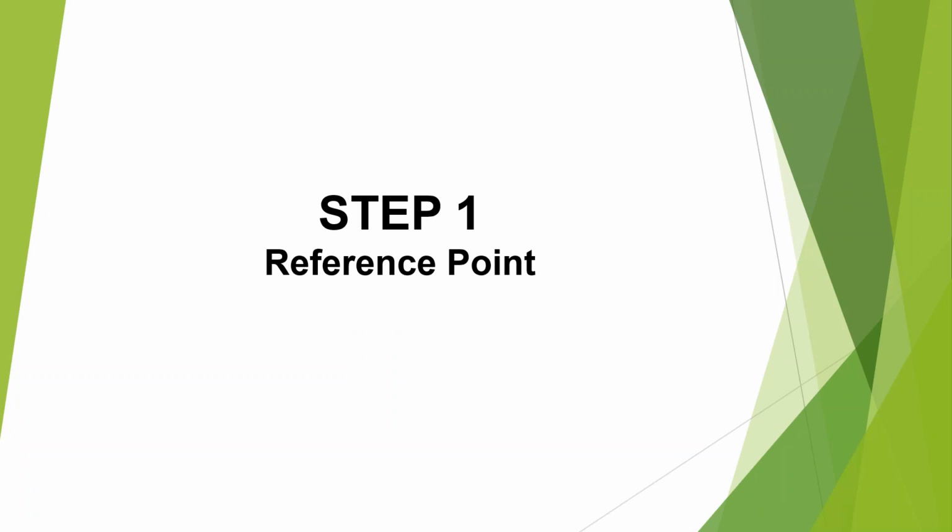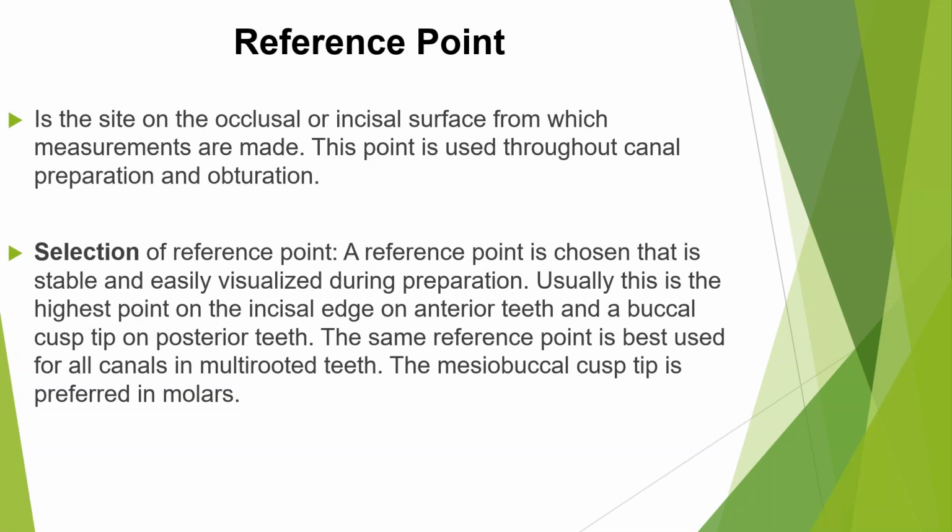So getting into the reference point, this is going to be the site on the occlusal or incisal surface from which measurements are made. And it's the point used throughout canal prep and obturation. When it comes to selection, a reference point is chosen that is stable and easily visualized during preparation.